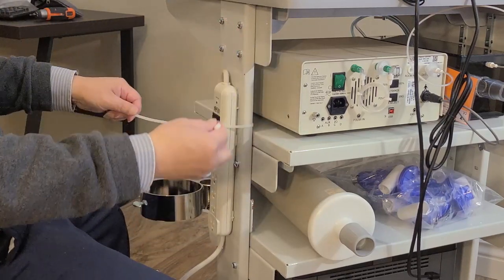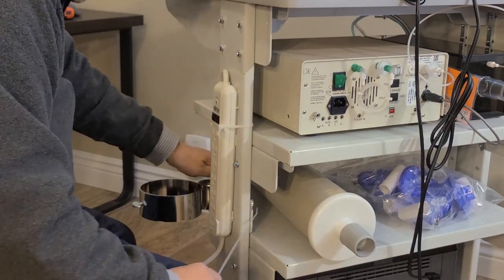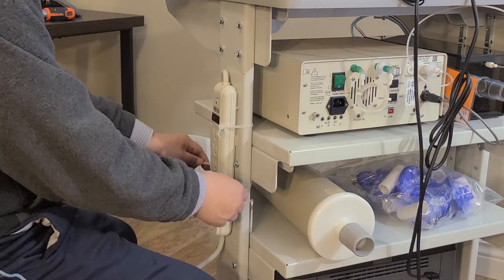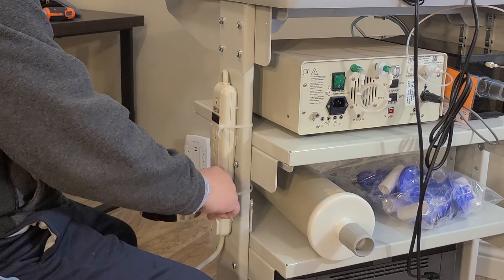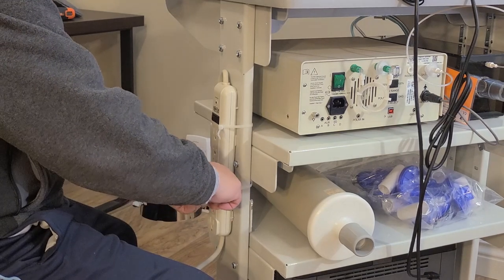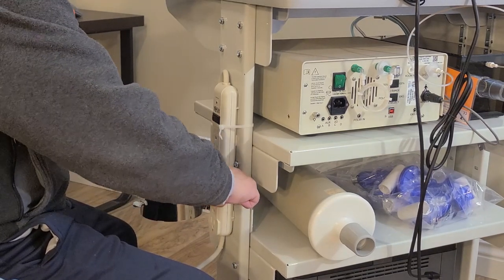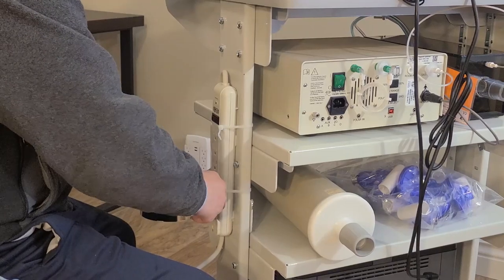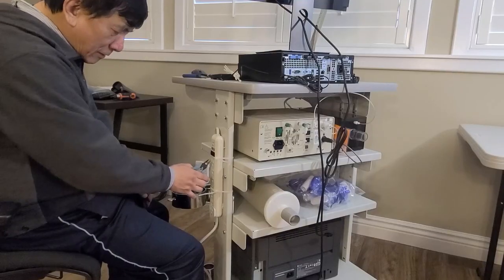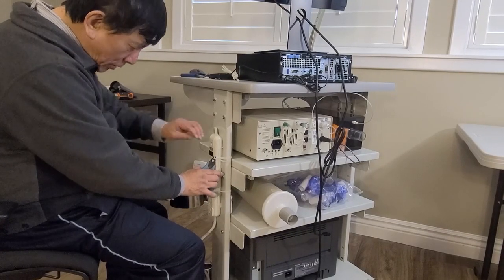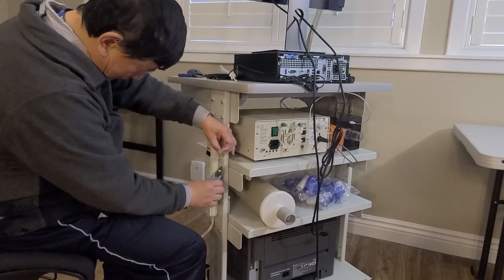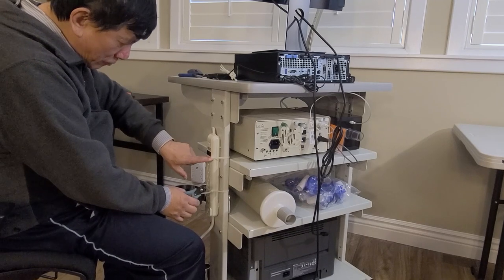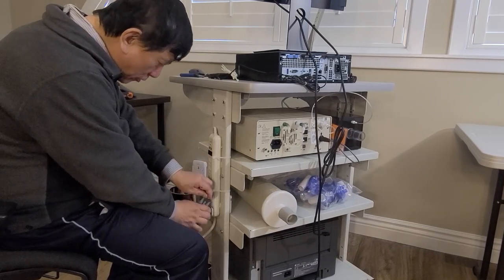Then you tie a second nylon tie under the fourth power socket. Then we cut the extra part. Just remember, you don't want extra tails poking out.